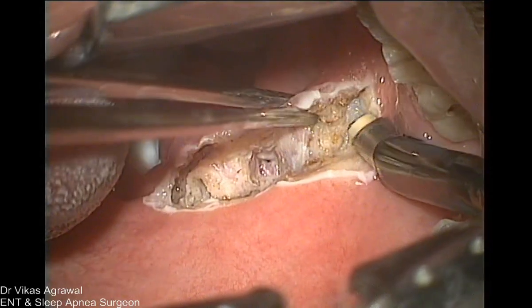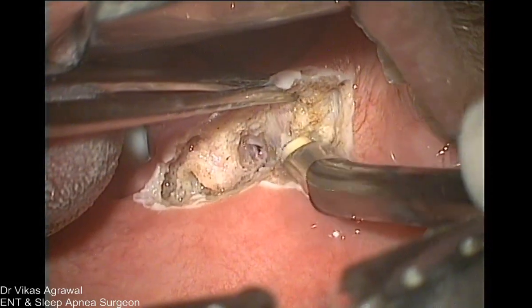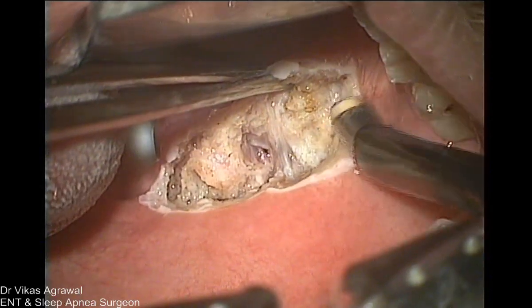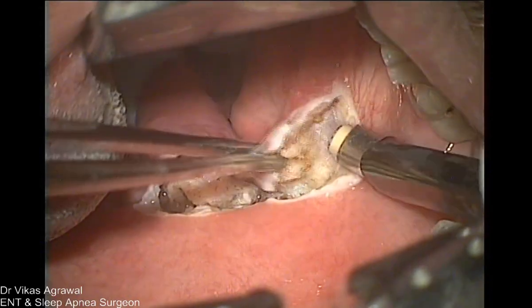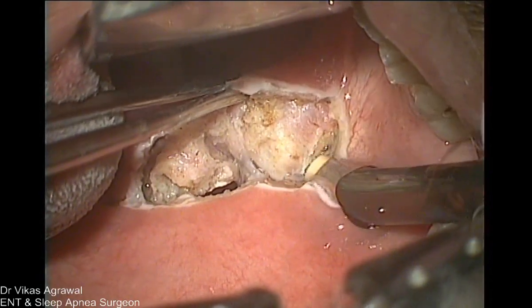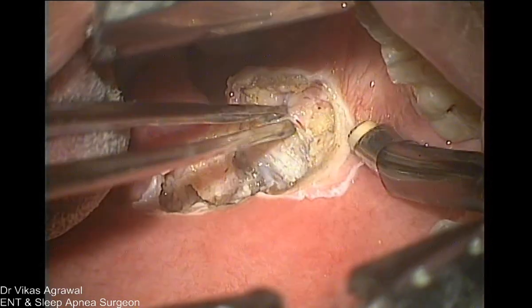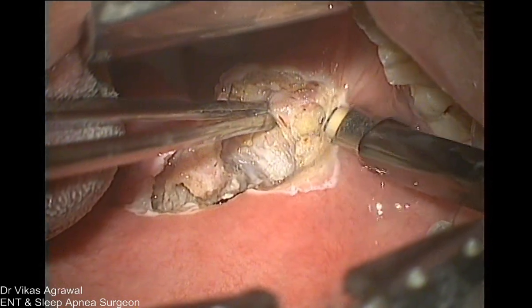Sometimes the upper pole of the tonsil can be really buried. Here also it's going up. Can you see this? See, this is the upper pole of the tonsil. See how it is going inside. This is all tonsil. See this? Here. Yeah, seen very well.